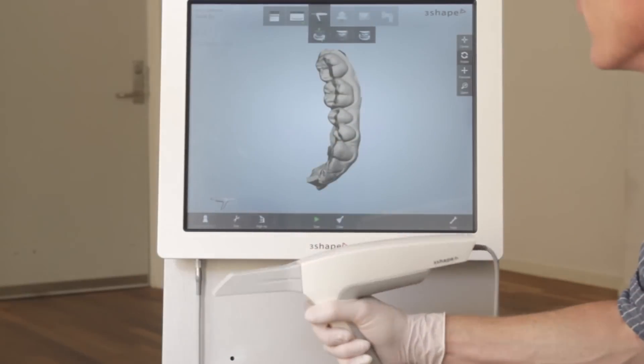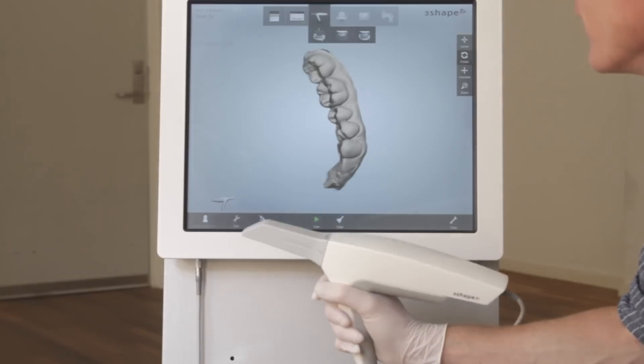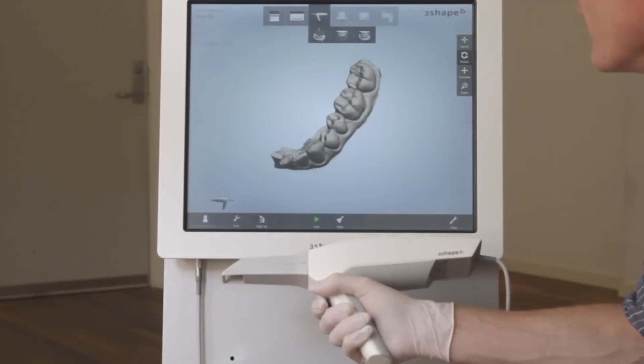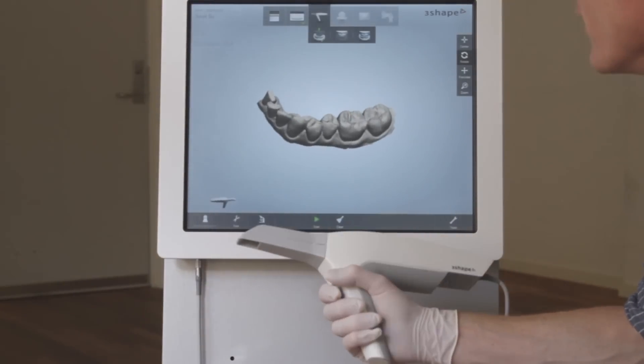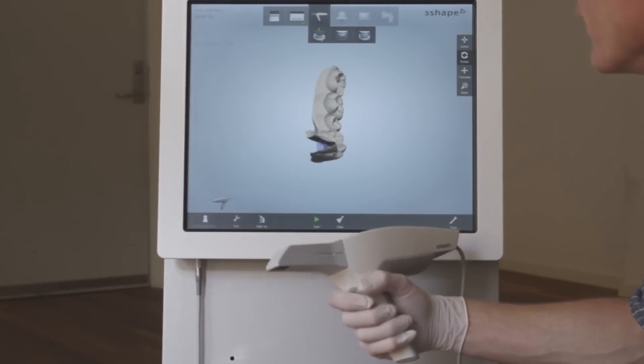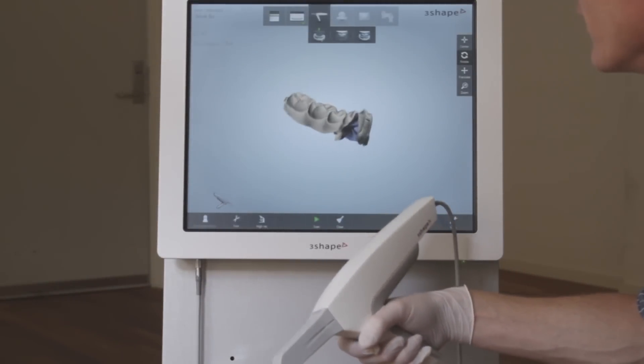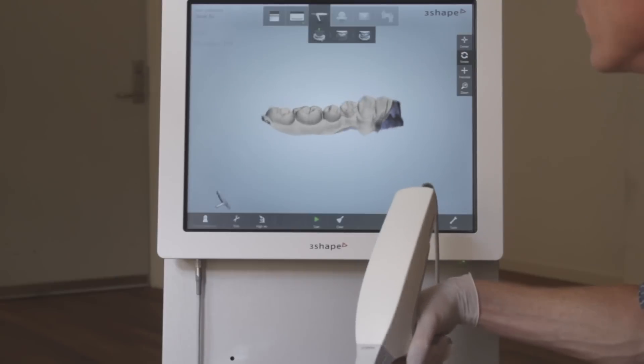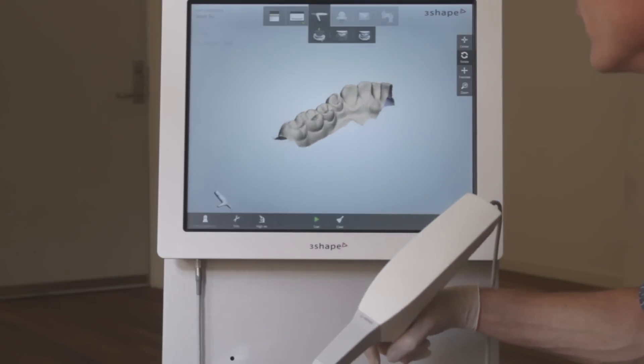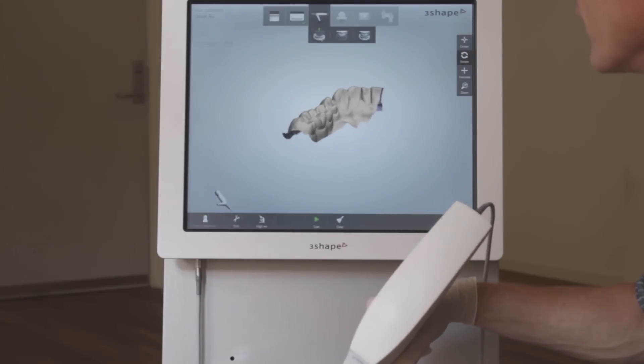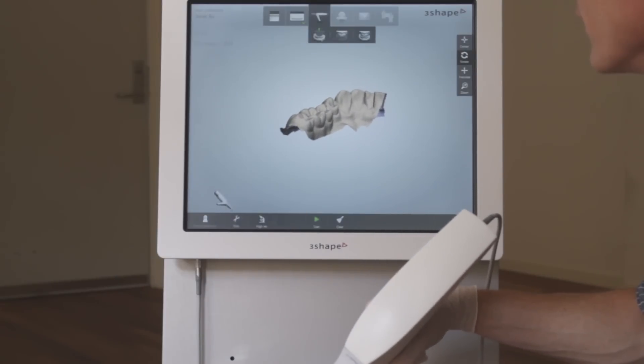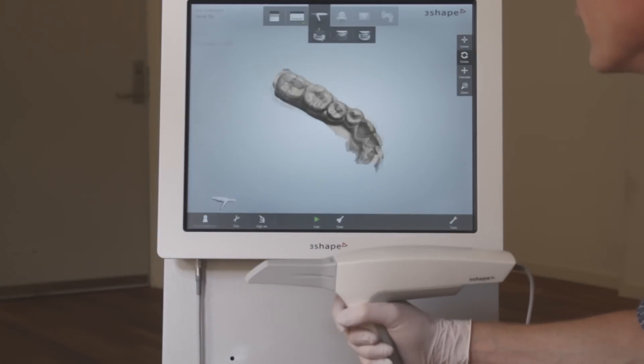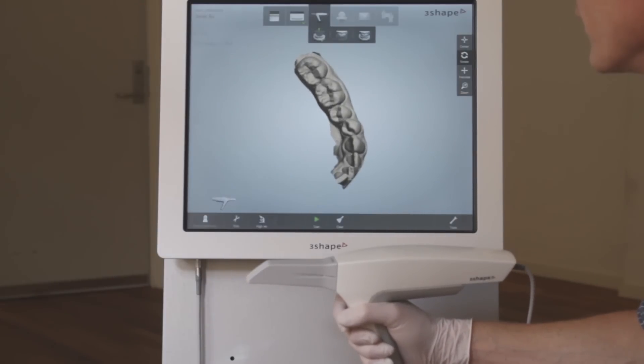When you have scanned and have your digital impression displayed on the monitor, you can rotate the 3D model by holding the trigger down while rotating the handheld. The screen's image of the 3D model will rotate accordingly.